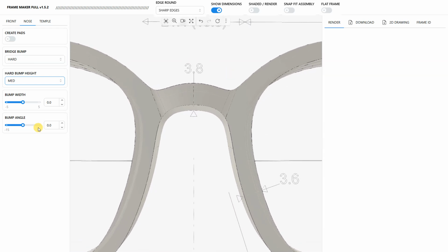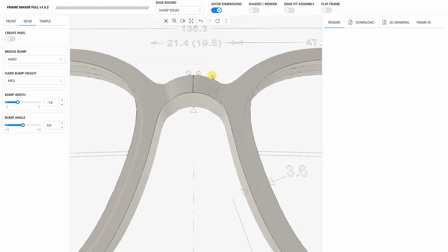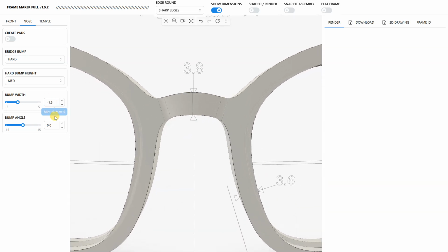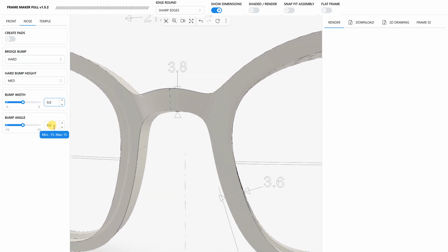And it has an additional feature here where you can play with the bump width. And this is basically, where is this happening? Where is this radius here happening? Where's the break, let's call it? So we can go, let's say we can go a bit to the left, like 1.6 millimeters. It's going to move. So I can adjust this depending on my frame shape. So there it is. I think it was okay the way it was originally, but just to illustrate what this does. And also the angle. For example, let's go back. I'm going to leave it at 0, right smack in the middle there. But let's say I wanted to tilt it so it's a bit more vertical. Again, I can give it some degrees of angle. So in that case would be minus 2.2, and it's going to tilt to the left. Hardly noticeable there.